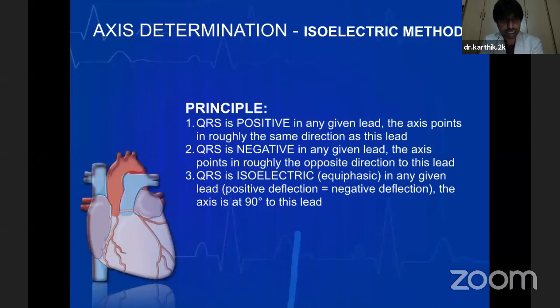If the QRS is isoelectric, suppose you're stuck and you come across a lead where the QRS complex is isoelectric, which means the height of the R wave is equal to the depth of the S wave in the QRS complex in that particular lead, then that is a null lead. That means there is no net deflection. So at this point, if you use your imagination of high school trigonometry, you can see that that is where the axis is perpendicular.